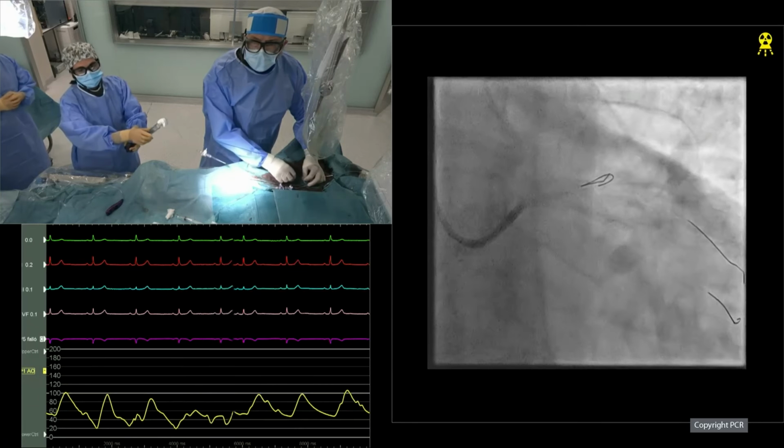Evald, anything else? Yeah, there's a question from the audience about the demonstration of the distal rewiring of the LAD before the kiss. Okay, let's first understand which balloon they are using in Madrid. So we have a 2.5 in the LAD and we're going to put a 3.0 in the circ. What was the question, Emanuele? About the balloon size that you're using. Yes, so we are planning to use a 3.0 placed in the circumflex and then a 2.5 to open the cells of the LAD. And then the question was about the wiring technique.